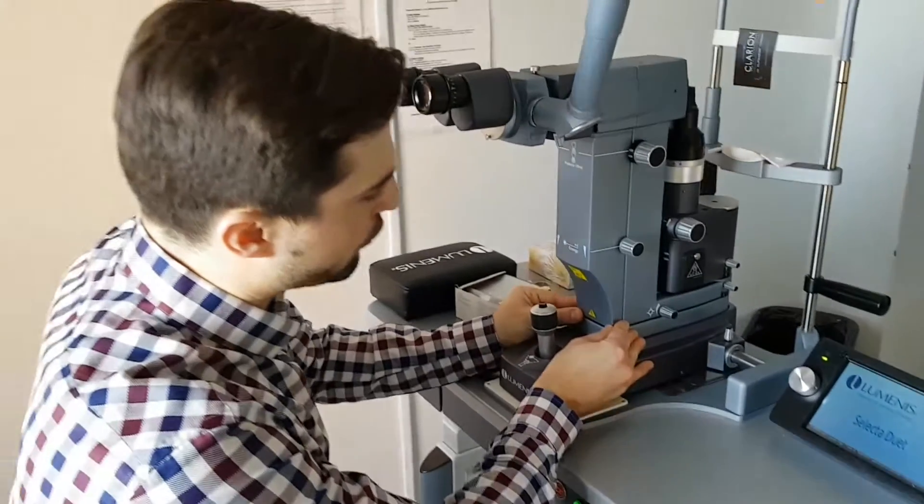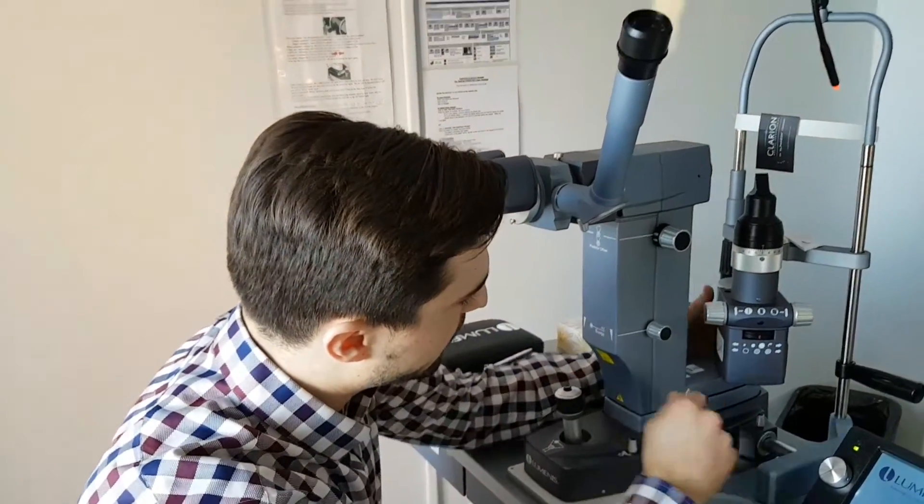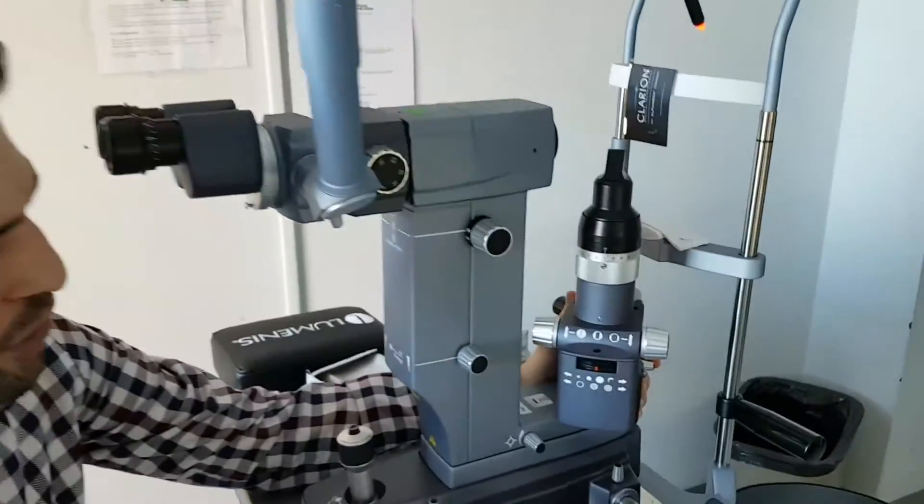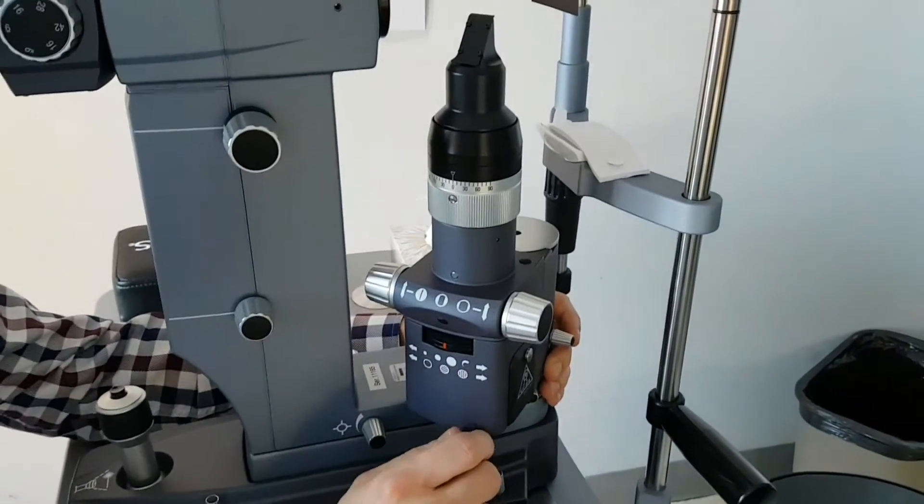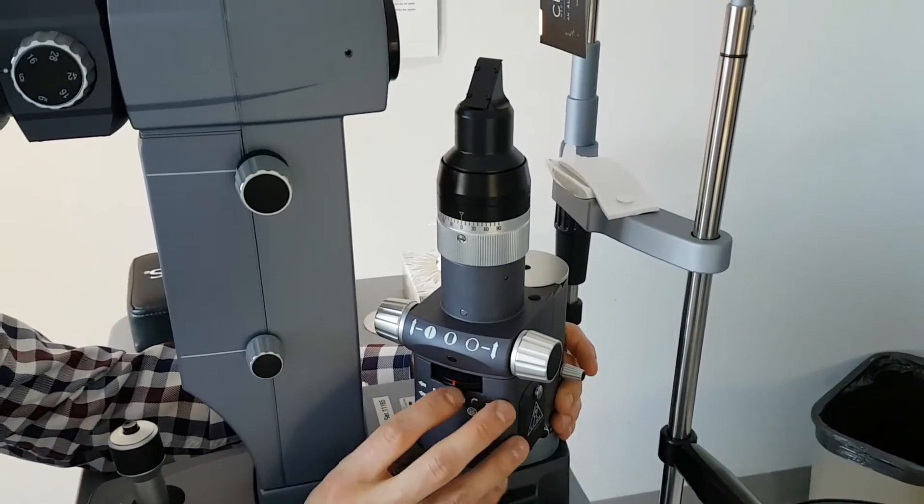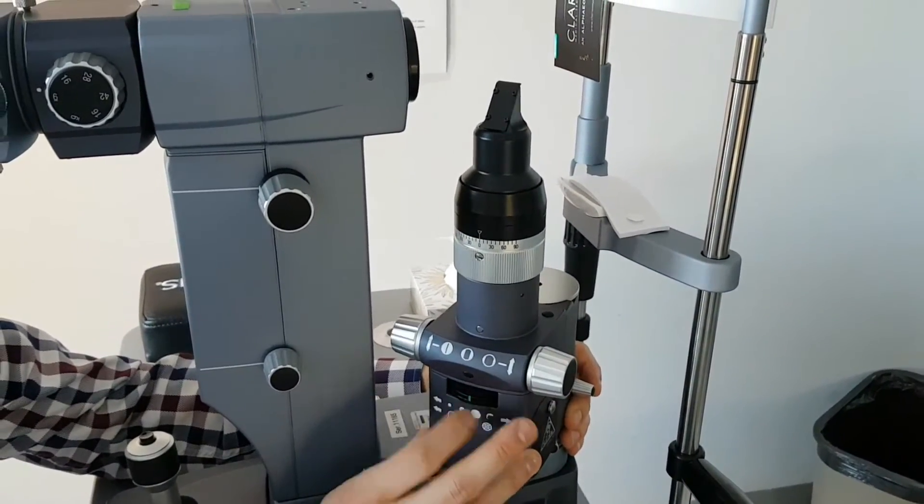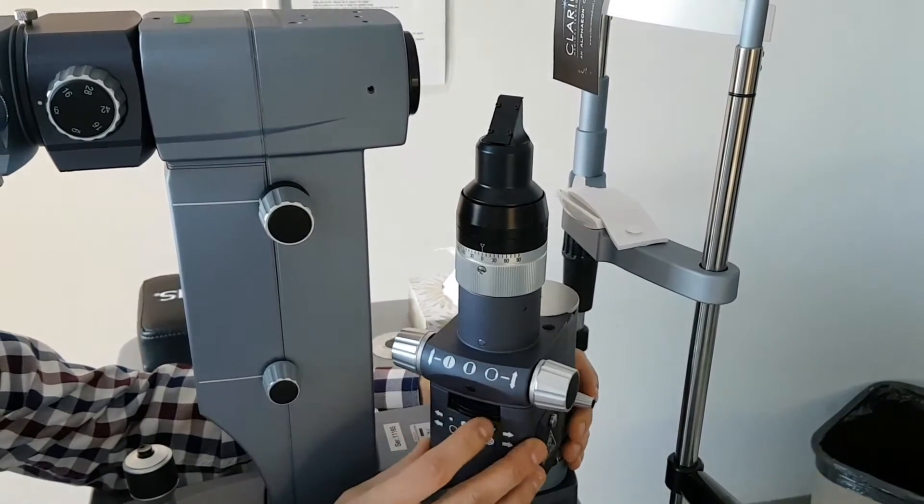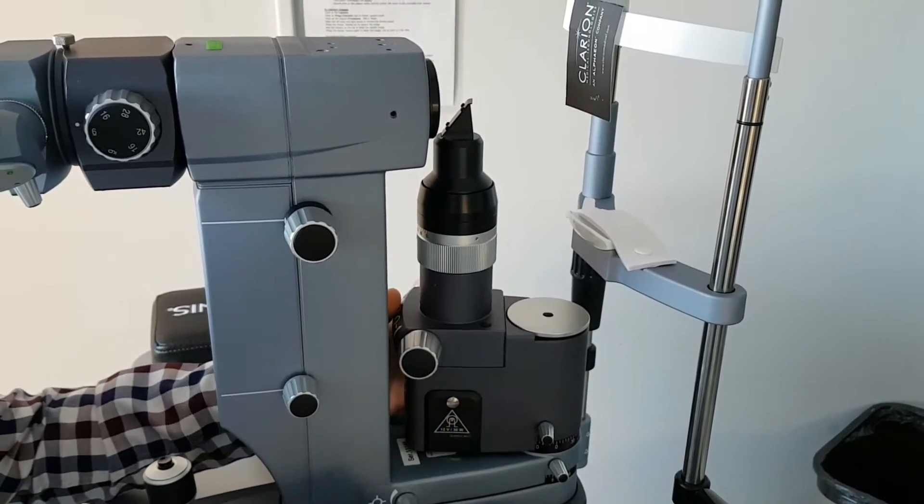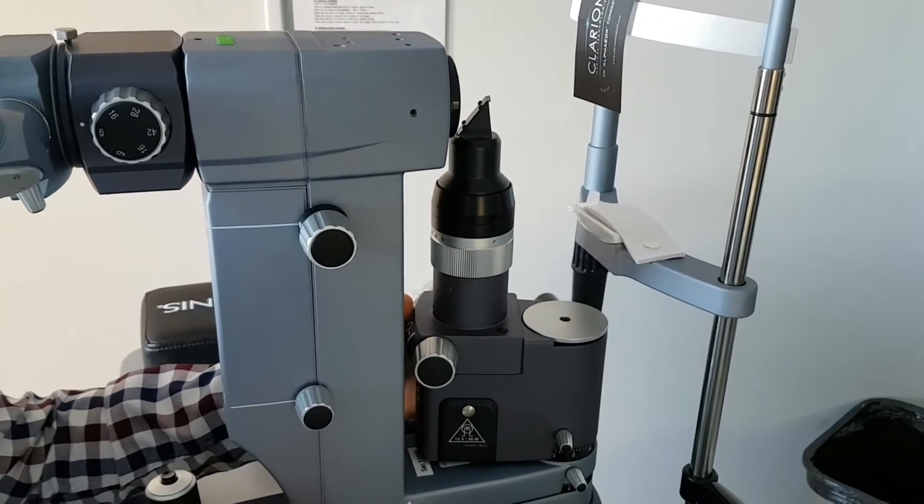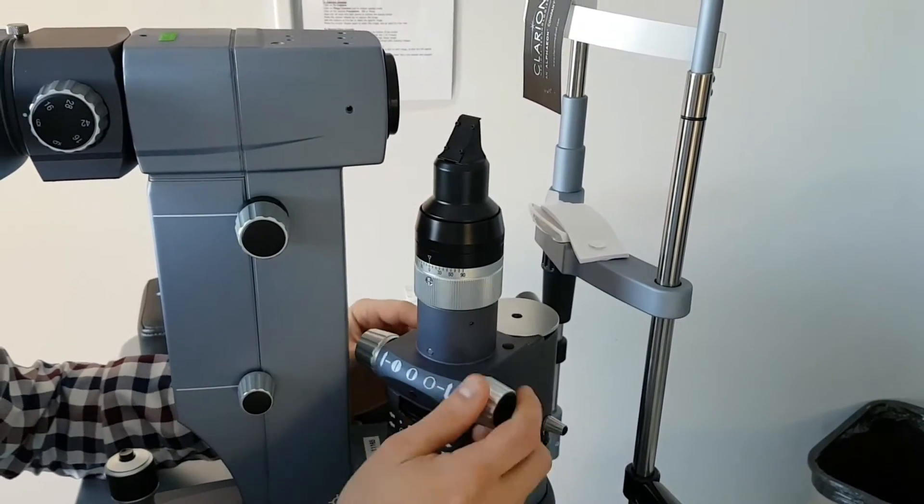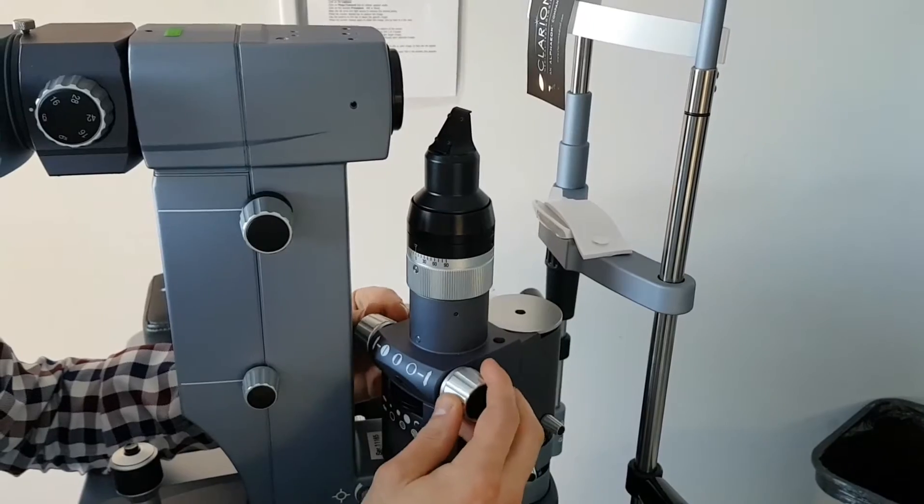If we move on to the slit lamp functions, you have initially those two wheels here that you can play with.